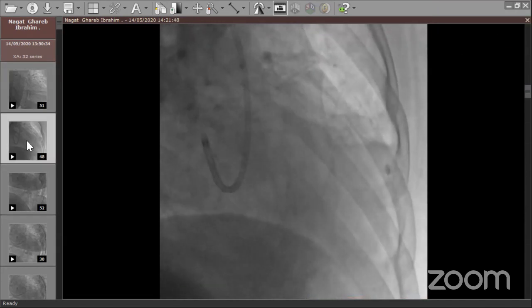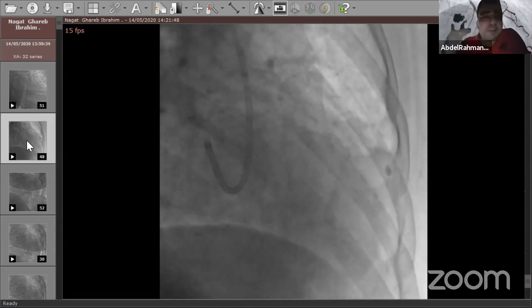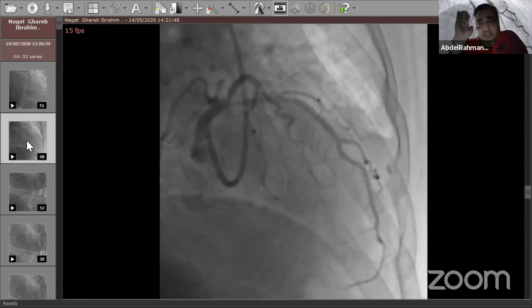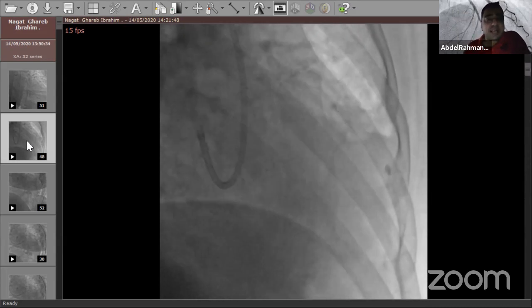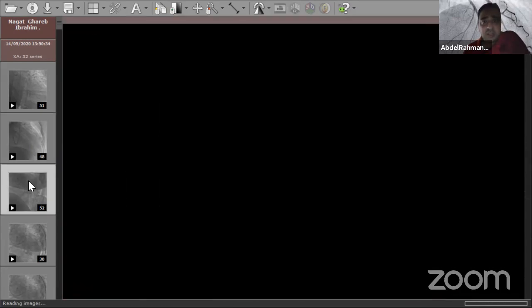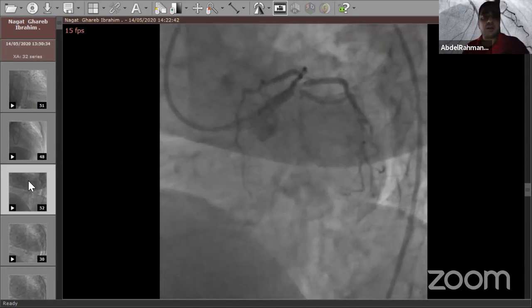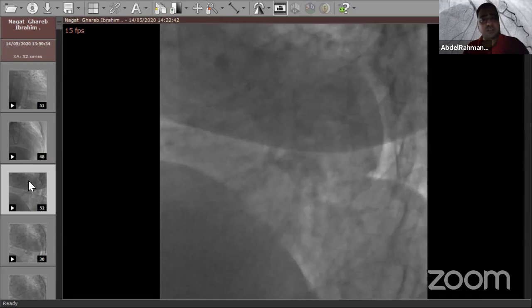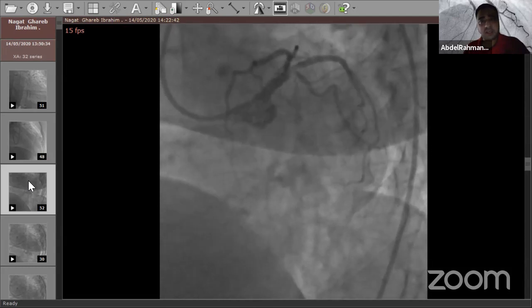Okay, so give us a hint about your strategy in this patient. Actually, I believe that this patient is very complex, because it is a true trifurcation lesion. So I decided to do all those lesions with a complex procedure. So I began with a 7 French catheter.